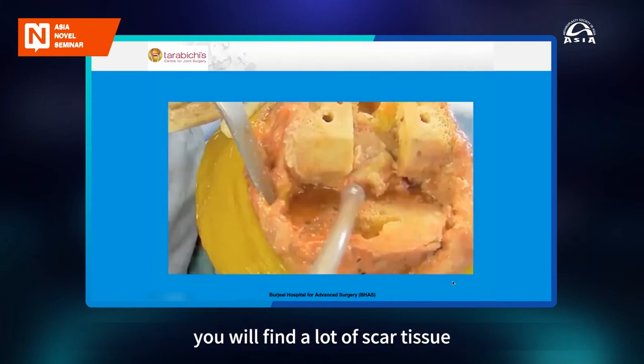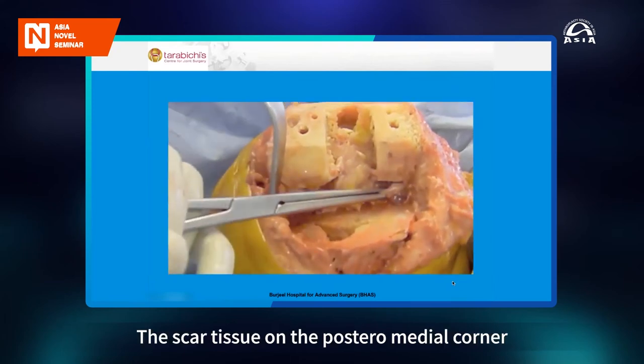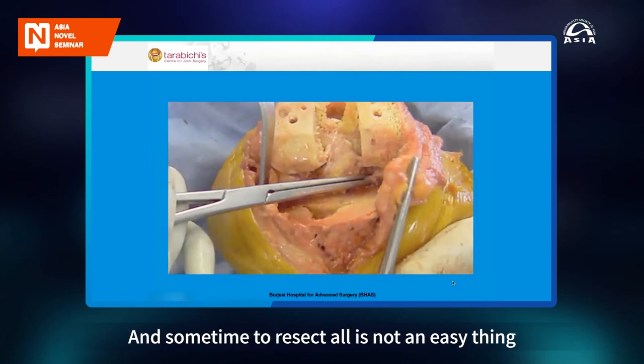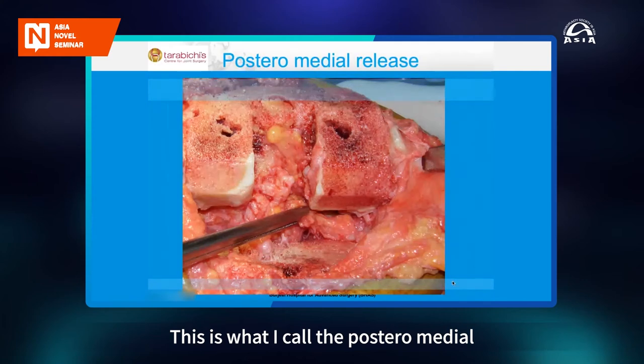And after that, you will find a lot of scar tissue. I'm holding here the scar tissue in the posteromedial corner. You could see me holding it and cut it. This is what you have to cut. And sometimes to resect it all is not an easy thing. You keep cleaning it out and you tend to have new scar tissue. This is what I call the posteromedial.